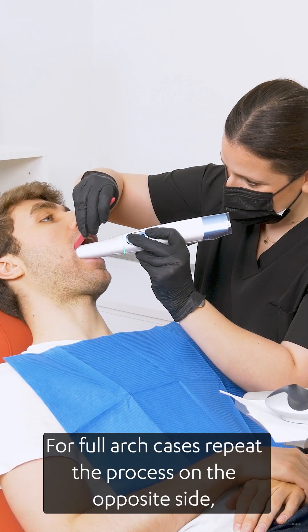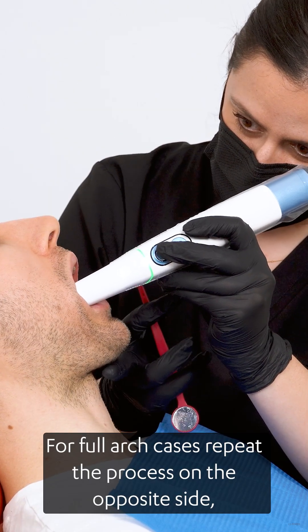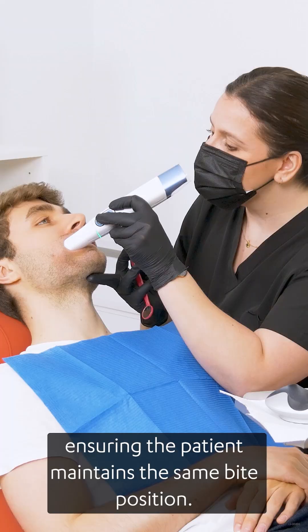For full arch cases, repeat the process on the opposite side, ensuring the patient maintains the same bite position.